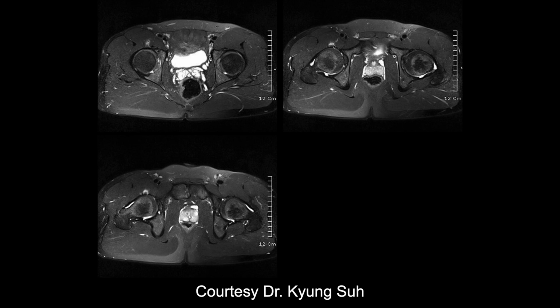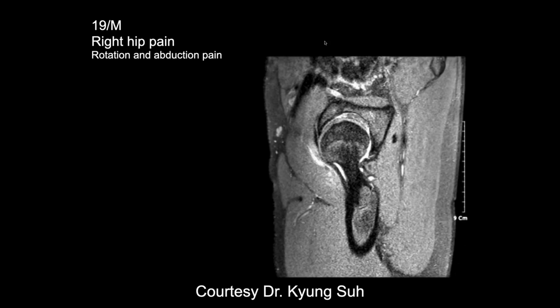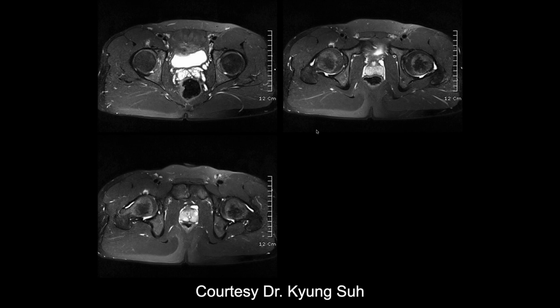So I'm showing different appearances here of iliopsoas disease. Now, this one has right hip pain with rotation and abduction. And we can see the edema right in through here. And then here you can see the edema right along where the tendon's coming at the myotendinous junction.